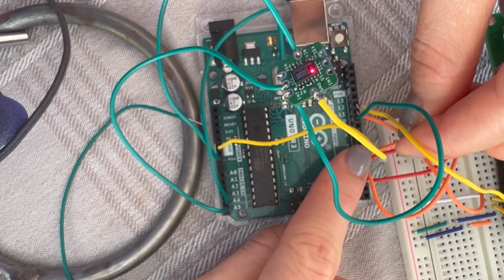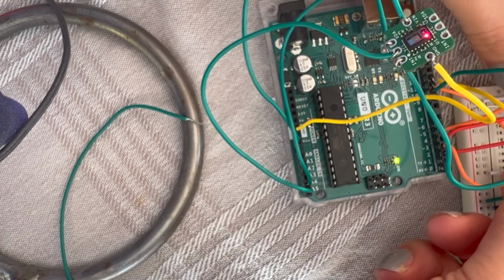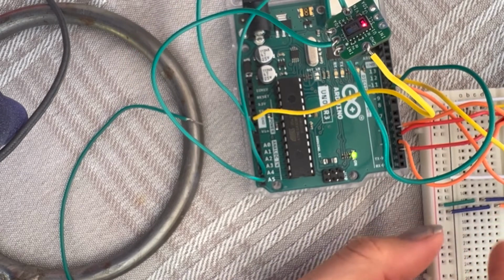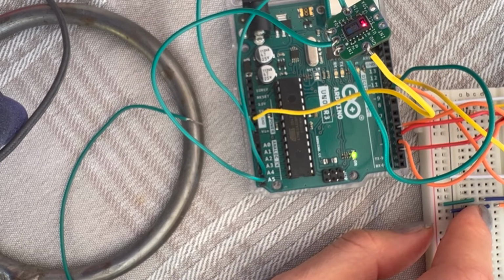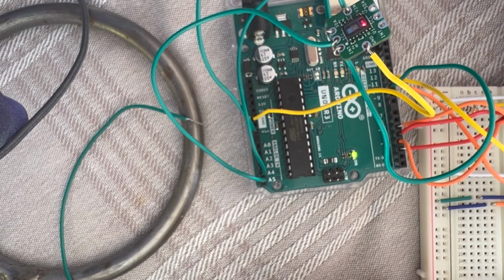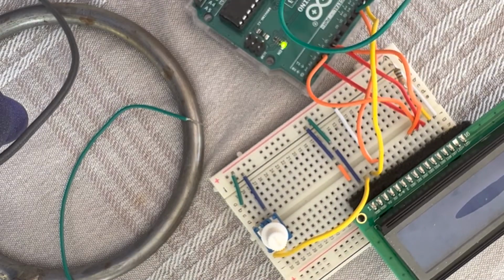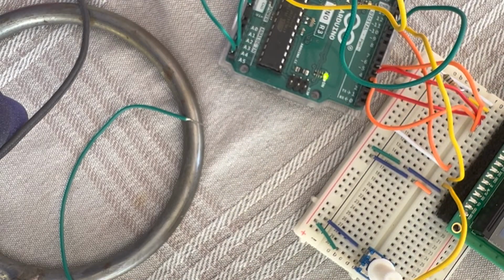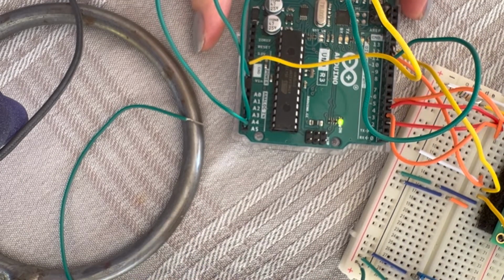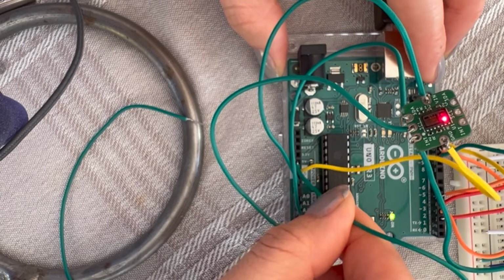Yeah, I know it's really messy. I wish I had a better way of connecting them. You can use these small pins to make it look cleaner. I think I should do that actually. Make it cleaner. It looks really messy now. You can see it's connected there, but it's not connected to ground and 5 volt. So the positive one, we connected to 5 volt on the board here.